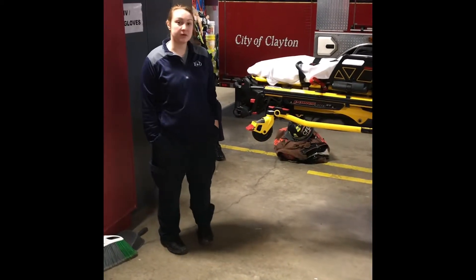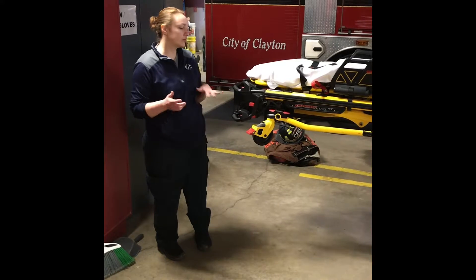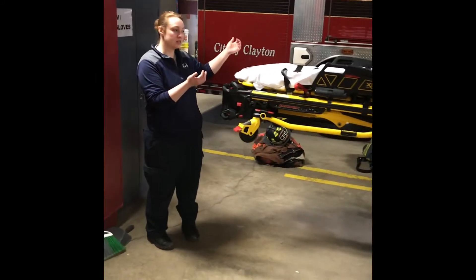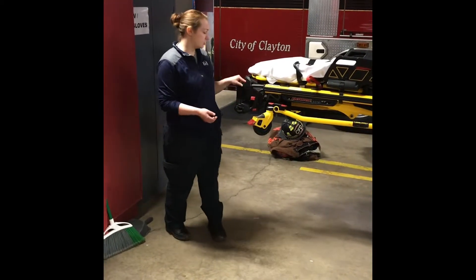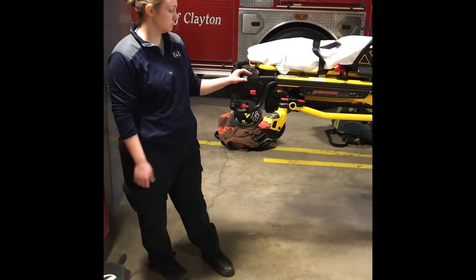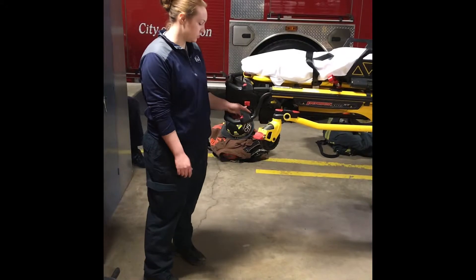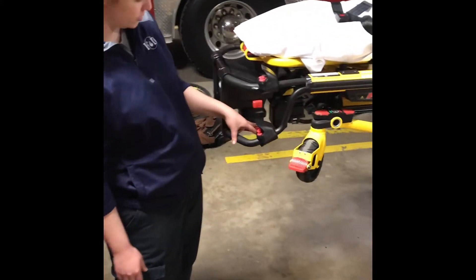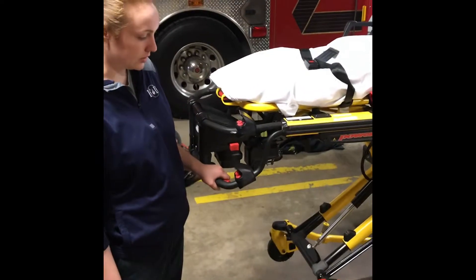Now we're going to talk about the manual controls for the cot and cot system. The cot is out and in the unload position. Let's say your battery is out, so your retract and release controls are not working — your battery is dead. You have a manual control right here, this little lever right under the battery, that you pull and it will lower your legs.